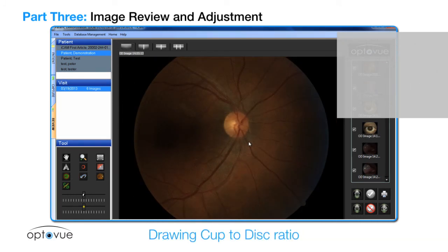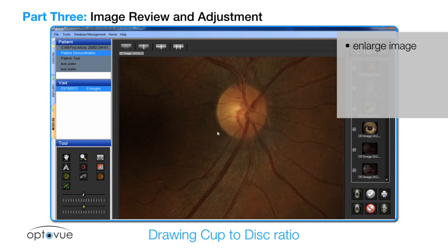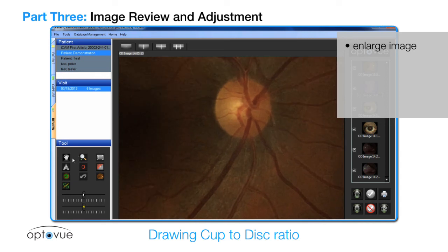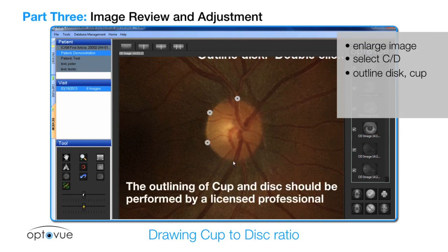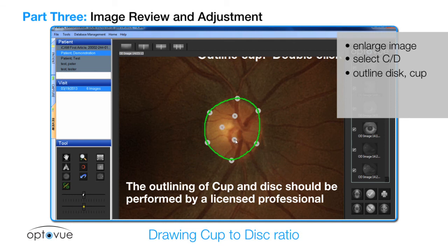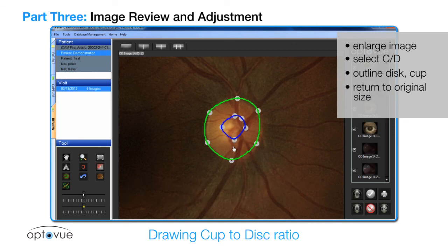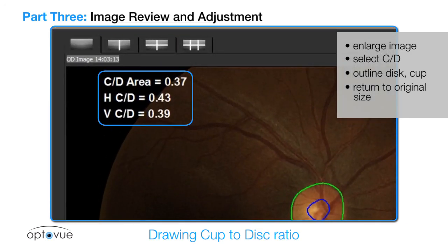To draw the optic nerve, enlarge the image of the optic nerve by outlining it with the magnification tool or by clicking and rotating the mouse wheel until it is the size you desire. Select the CD button. Then starting at the top, outline the disc by clicking sequentially around the rim, then double-click to finish. Outline the cup using indicators such as coloration — cupping is usually paler — and the shape of the blood vessels; bends and disappearing vessels may indicate the edge of the cup. Double-click to complete the circle. Return the image to the original size using the mouse wheel or the fit image button. The cup-to-disc information will be displayed on the screen.